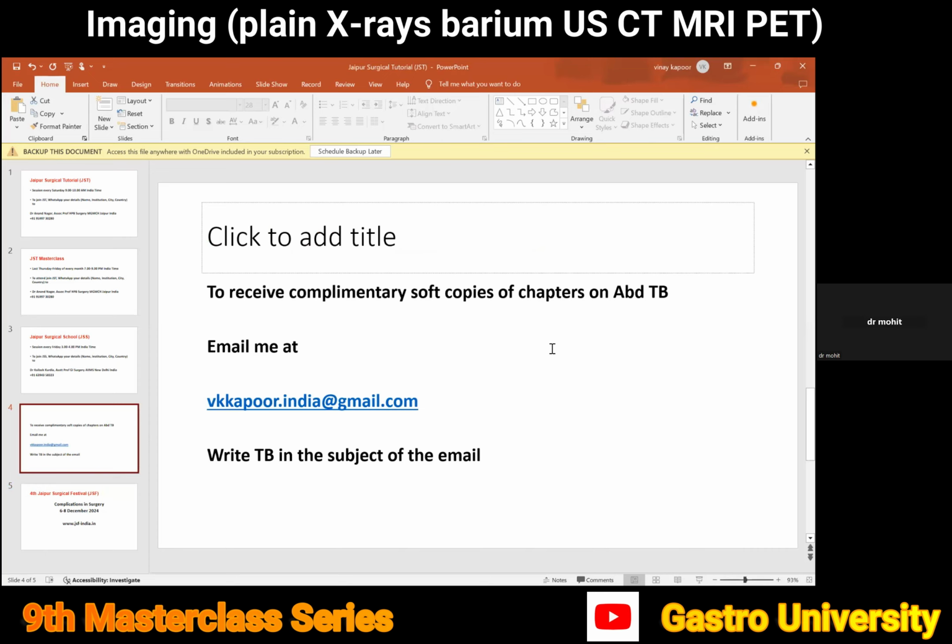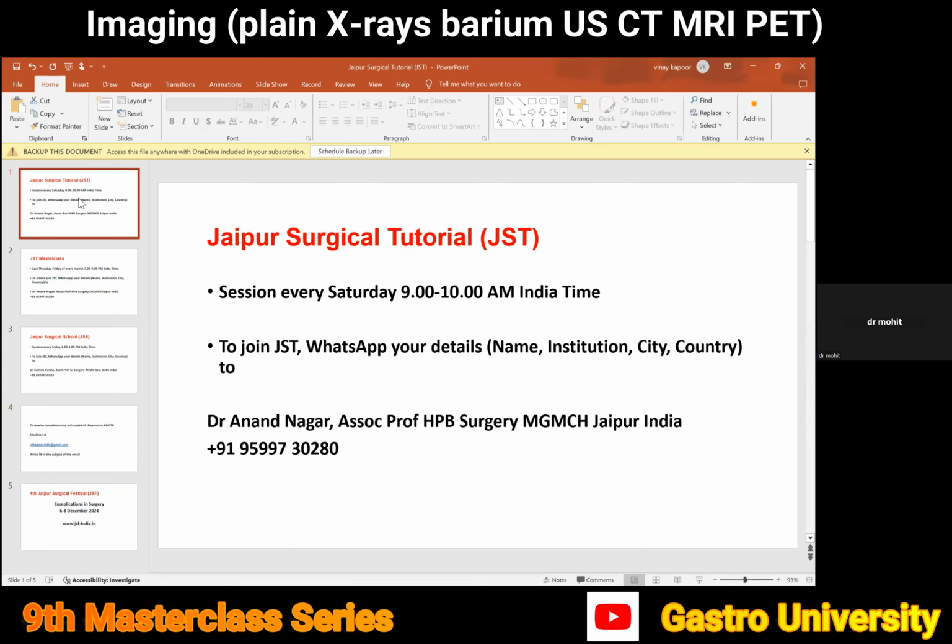Yes, sir. So my second question is, many of the patients who come to us already have a history of some carcinoma. They go to medical oncology, and they directly do the PET CT instead of CECT or some other investigations. So should we go for CT abdomen again after PET CT, or should we rely on the findings of PET CT, sir? Yeah, a very good question.